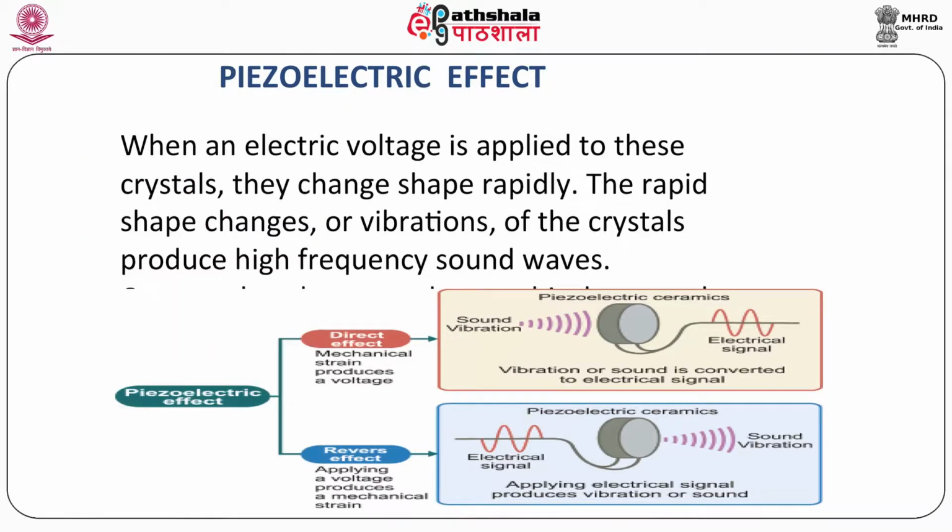Now coming to the piezoelectric effect. When an electric voltage is applied to these crystals, they change shape rapidly. The rapid shape changes or vibration of the crystal produce high frequency sound waves, as you can see here. Conversely, when the sound waves hit the crystal, they emit an electrical signal back.